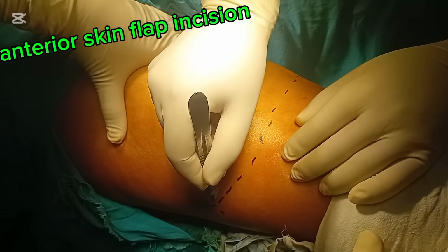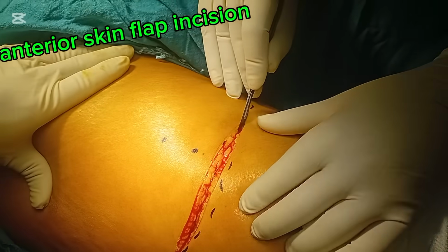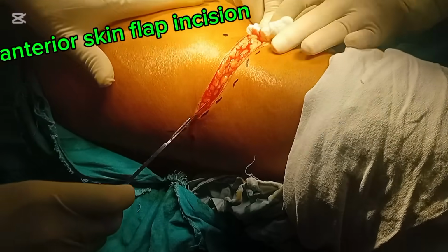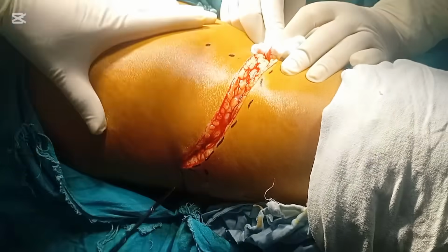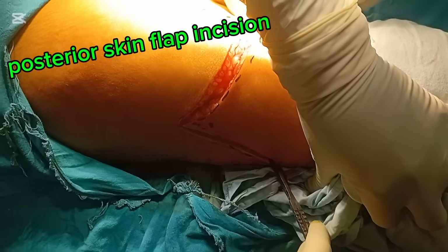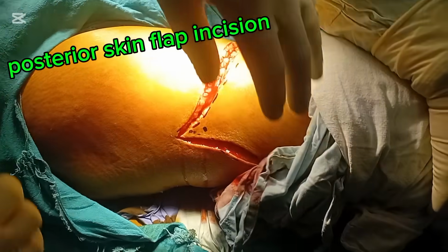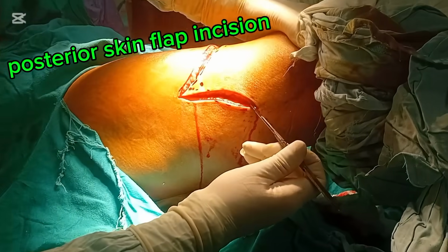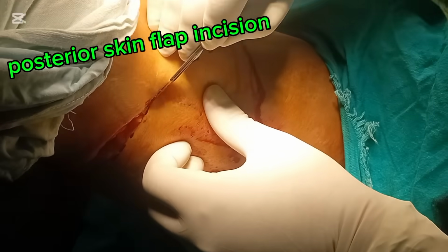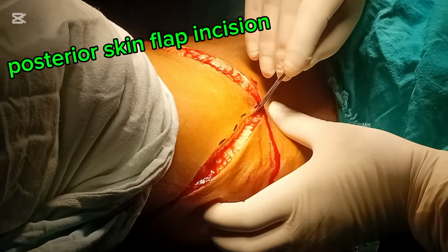Now we will first go on the anteromedial aspect of the thigh to create the anterior skin flap. Now we'll go on the anterolateral aspect and then the posterolateral aspects of the thigh to create the posterior skin flap. The posterior skin flap is 2 centimeters longer than the anterior flap. A skew flap is used for the coverage of bone on the independent part, not on the dependent part.